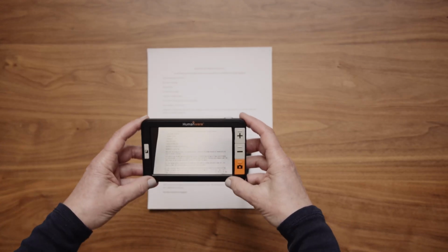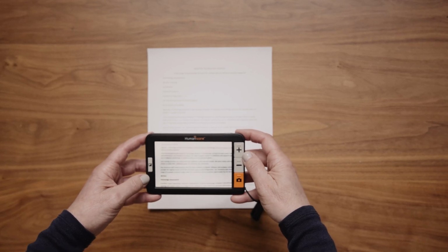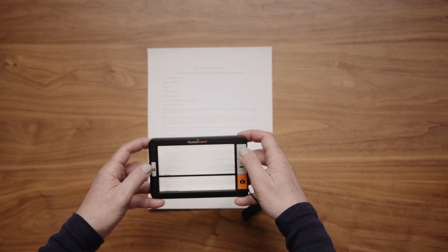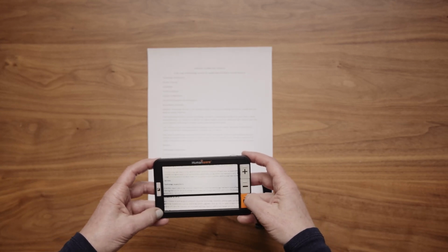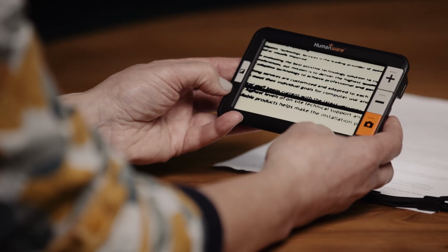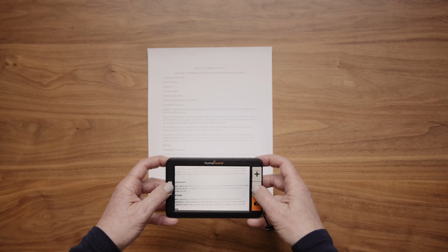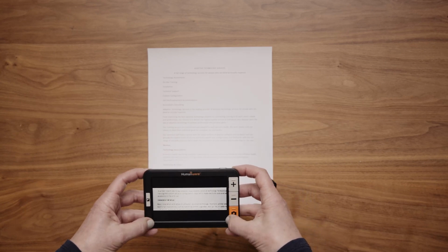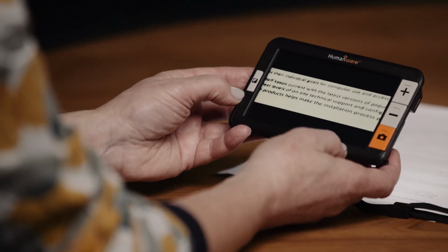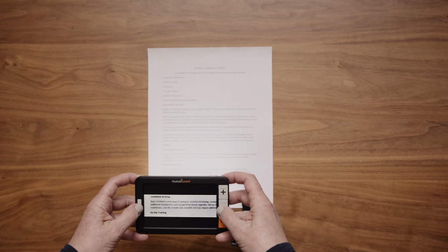Line and blinds features. Use these features to better track the lines you are reading. The line mode shows a horizontal line on the screen to make it easier to stay on the same line of text as you move the device across a document. The blinds mode hides the top and bottom of the image on the screen, so the device only shows a horizontal window of the image in the center of the display.